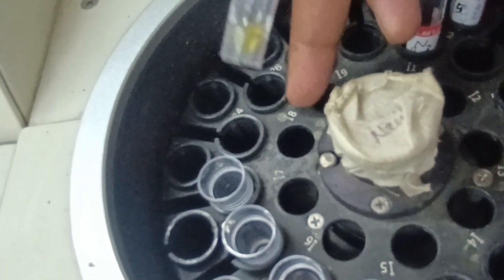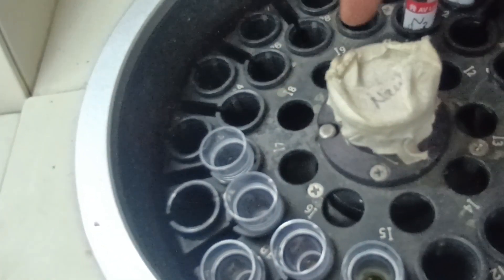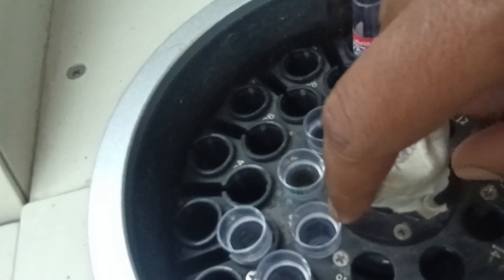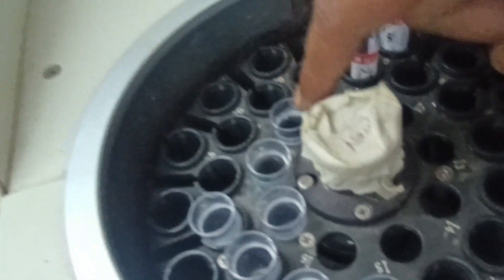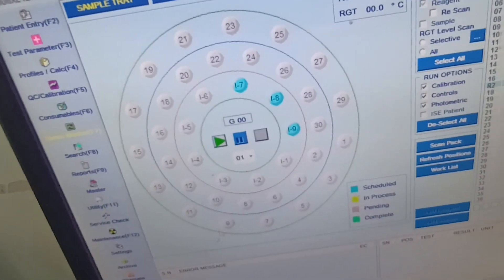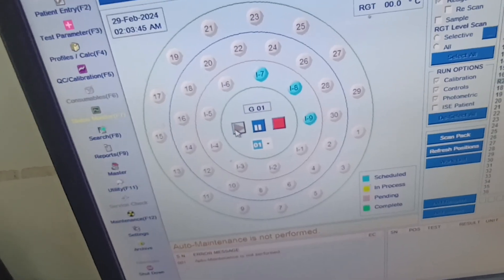The I8 position will be the calibrator and I9 will be the control. After successful programming, press the Start button. You have to load the control, calibrator, and sterile water according to their positions: I7 is sterile water, I8 is the XL multiple calibrator, and I9 is the control. The calibration procedure will then start automatically.